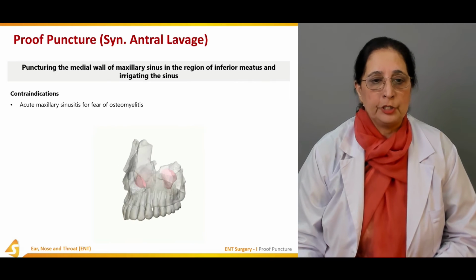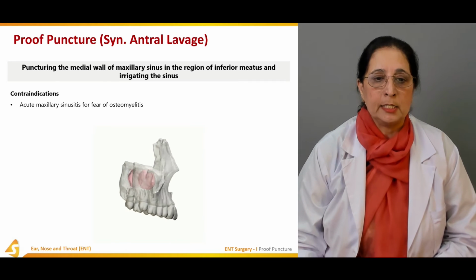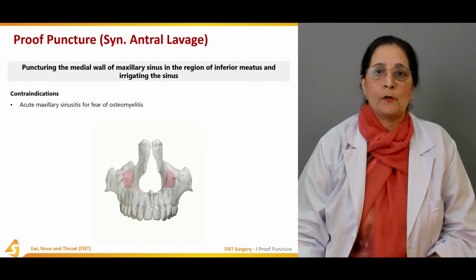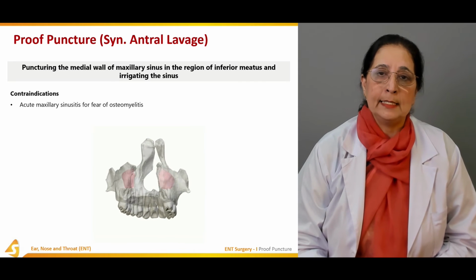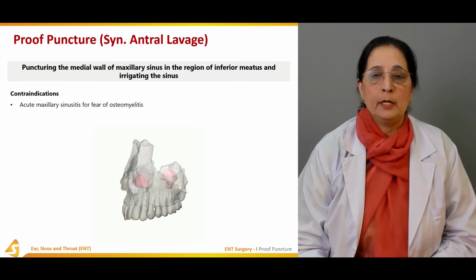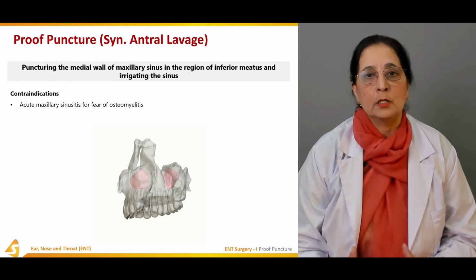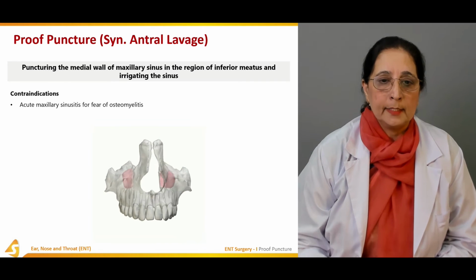Contraindications of this procedure: we have acute maxillary sinusitis, for fear of osteomyelitis. So in patients who have acute maxillary sinusitis, this should be avoided because it can cause osteomyelitis of the maxillary sinus.